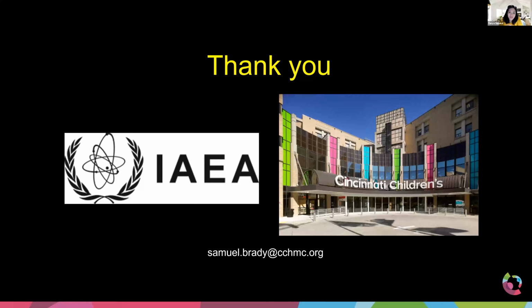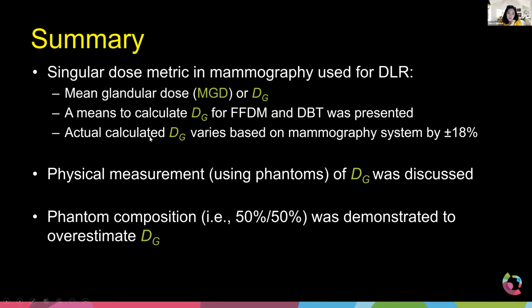So one thing that I got from your lectures is that it seems a little bit complex for the dose on the mammogram, because it depends on the vendor, the machine, and the filter. Yep. And it's not user-friendly when we're trying to collect the data for the mammogram, which is going to cause a lot of issues for us.